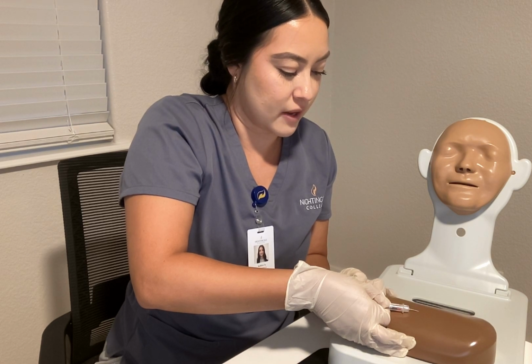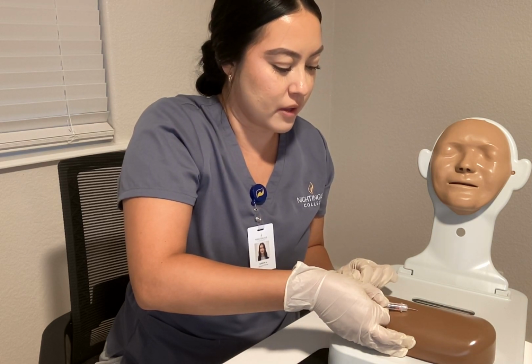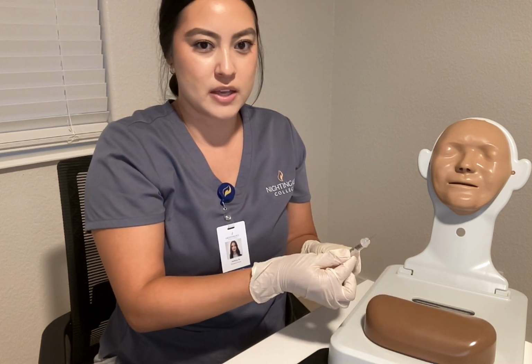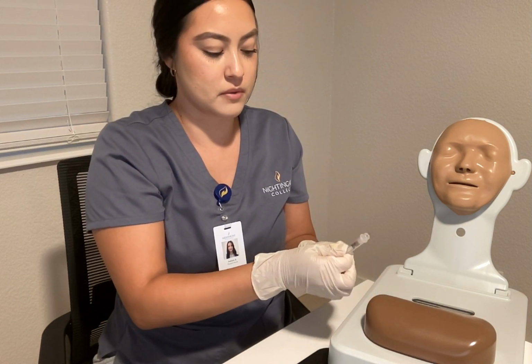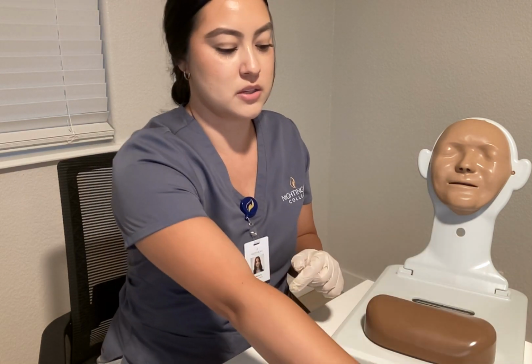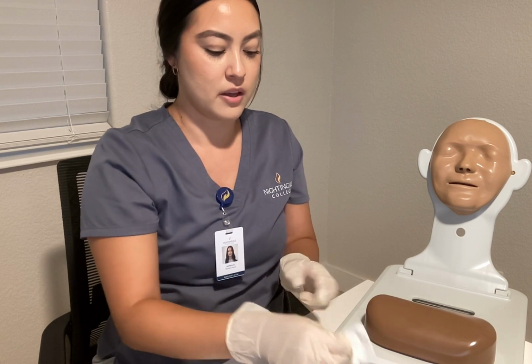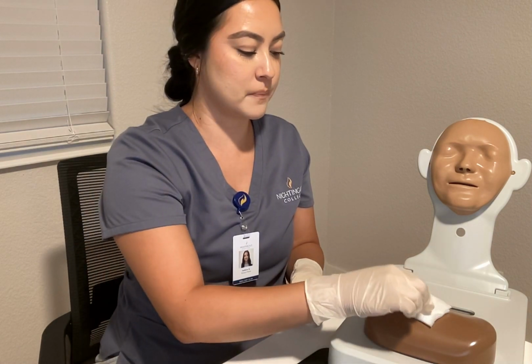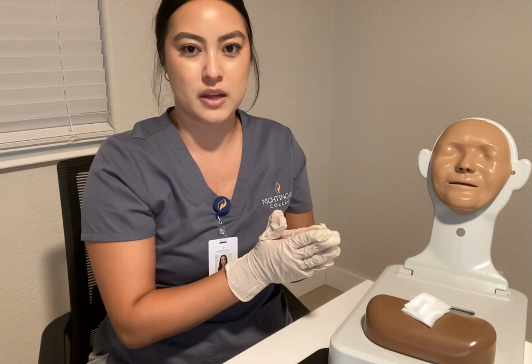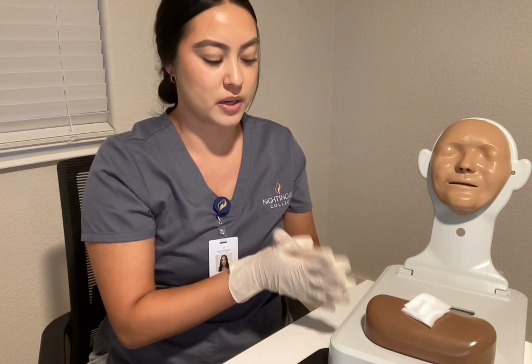Perfect, Mr. Smith. We have successfully developed the wheal. I would go ahead and pull out. In this instance, this does have a safety guard, so I would apply that. Then I would discard this into this sharps container. Then I would take my gauze and place it over. I do not want to press on the actual wheal because that is the reason why we created it. We do not want to get rid of it.